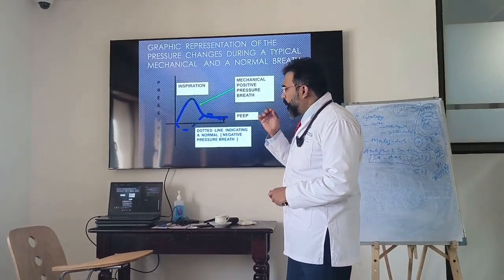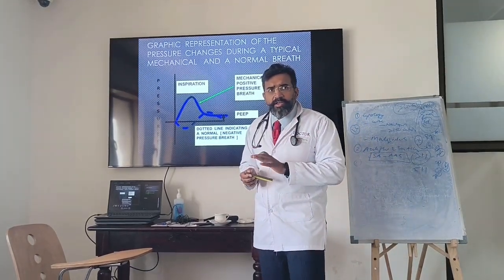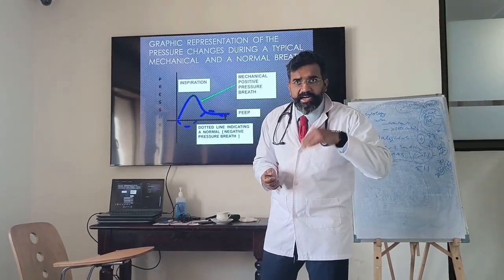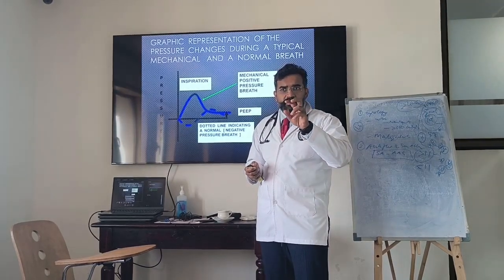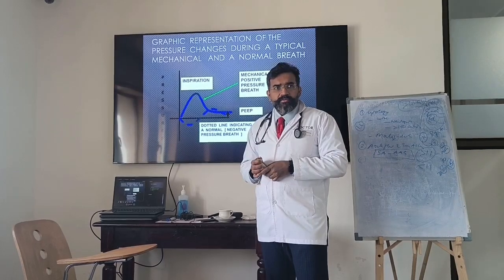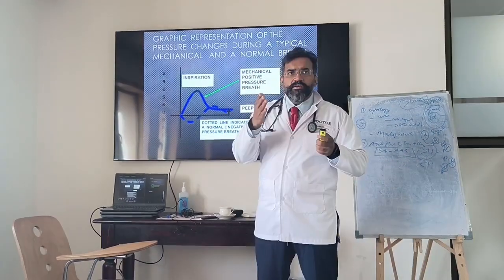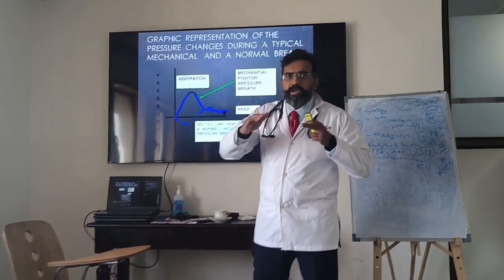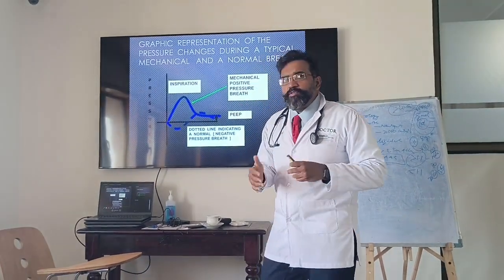Now what is the difference between spontaneous breathing and mechanical ventilation? Mechanical ventilation is actually positive pressure, whereas spontaneous breathing is negative pressure. Did we construct the plateau pressure curve the other day? Plateau pressure. P1 more than P2. Do you remember? P1 more than P2, then air goes inside and the plateau forms, and then it goes up. We discussed that, right? That is because it was positive pressure.